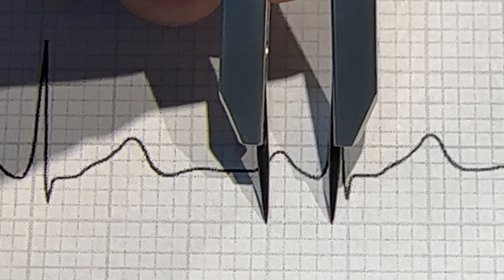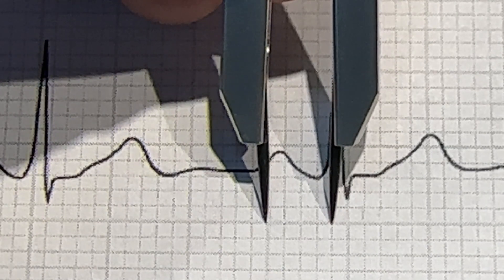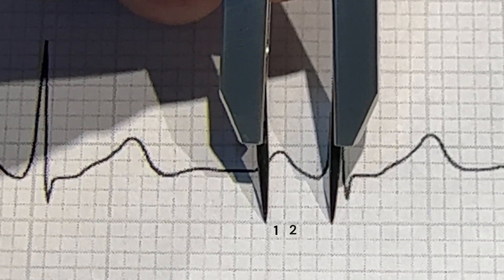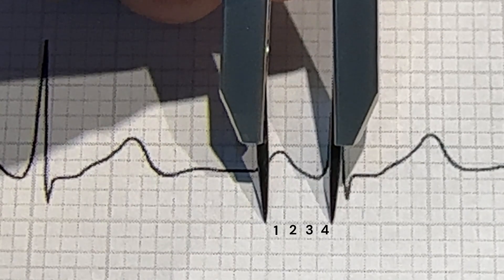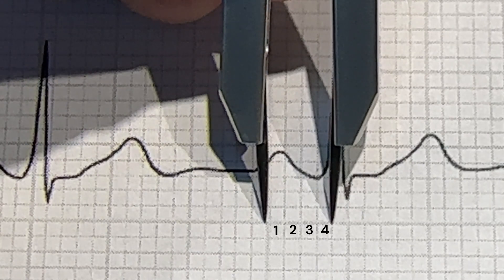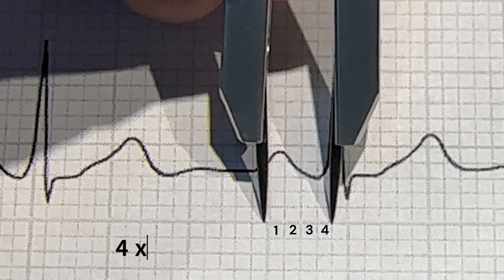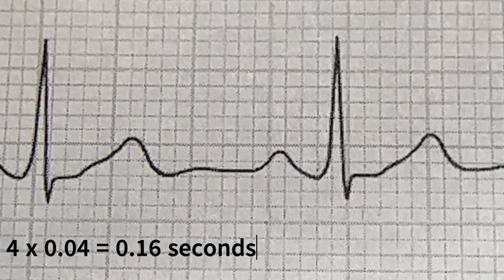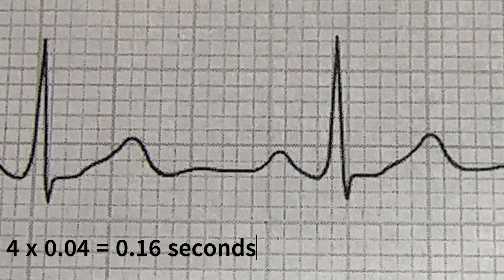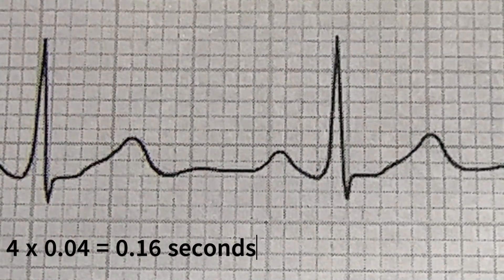Place the tips of the fixed caliper over visible small squares and then count the number of small squares between the caliper tips. Multiply the number of small squares by 0.04 and this will give you the measurement of your PR interval in seconds.